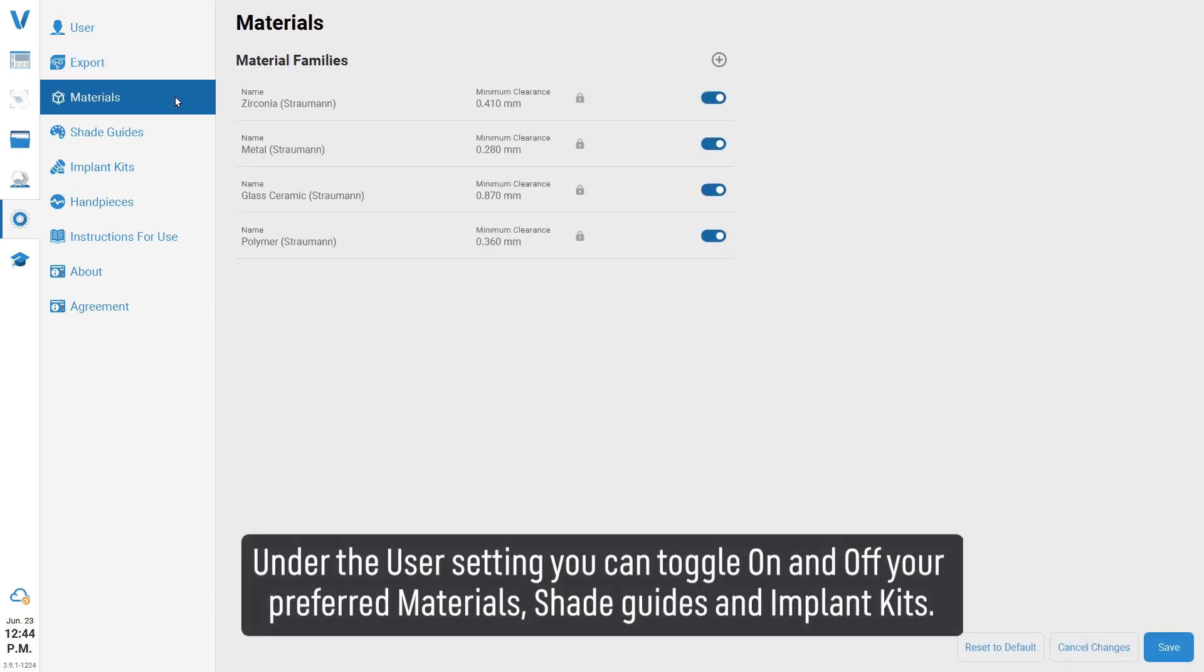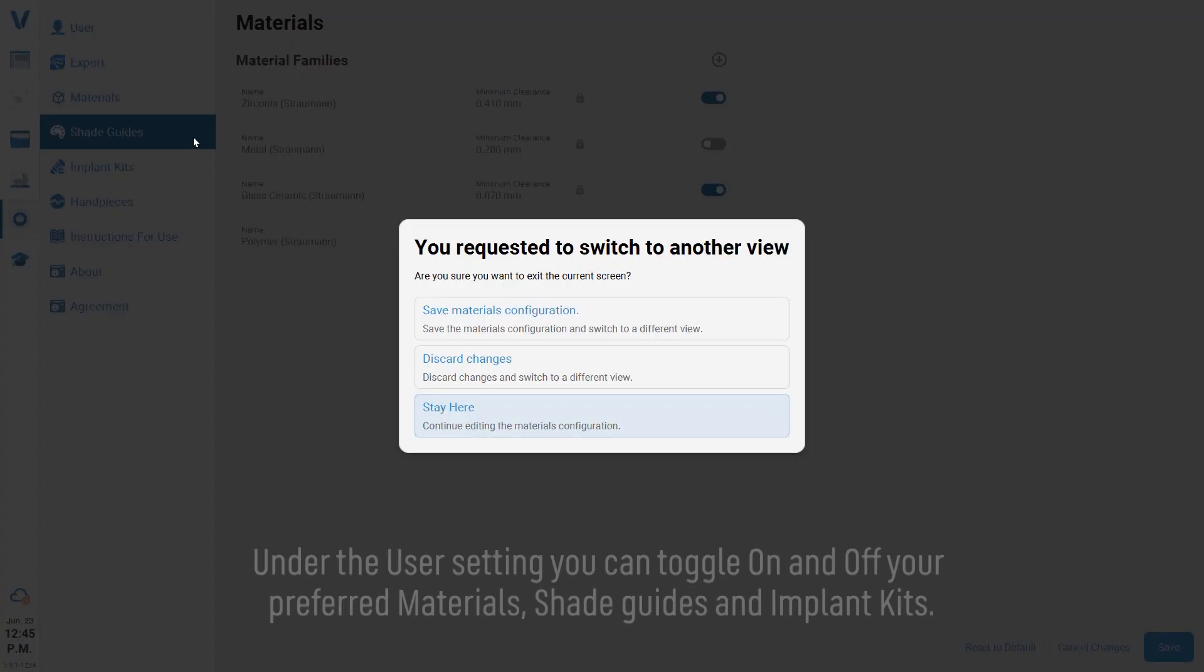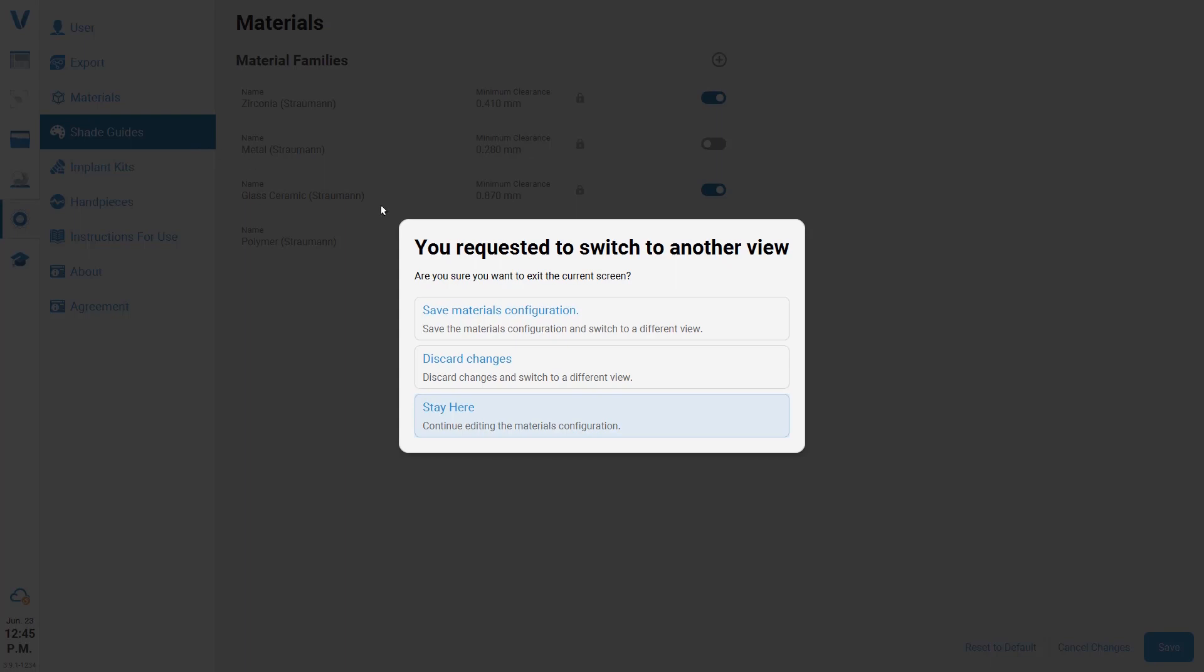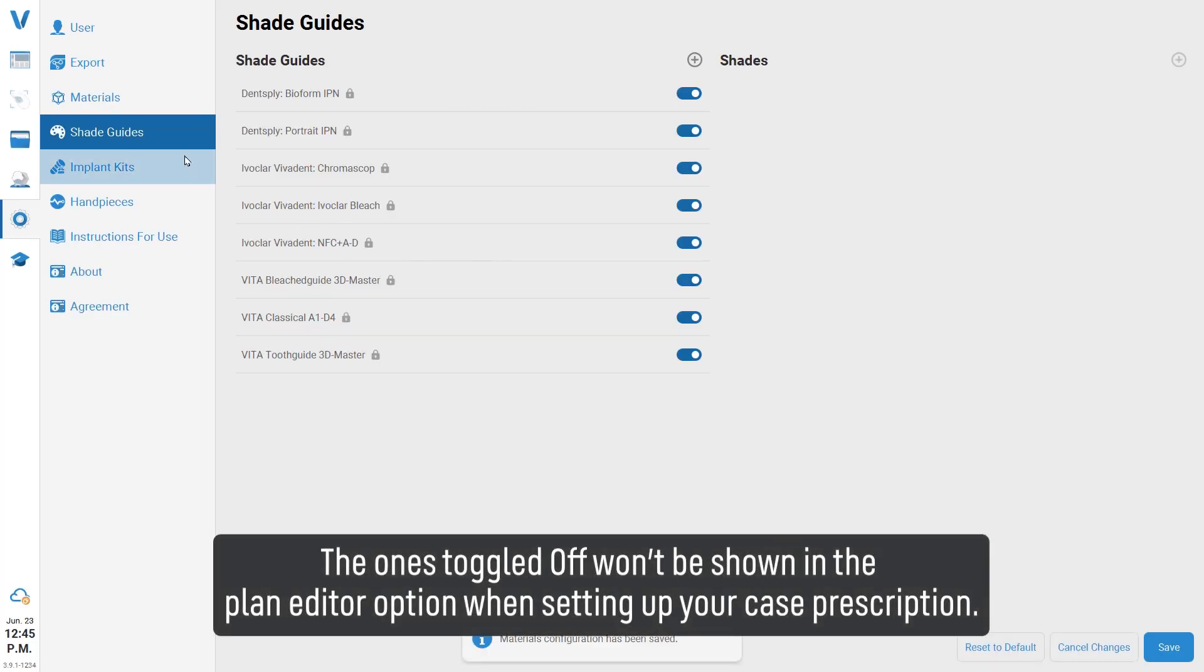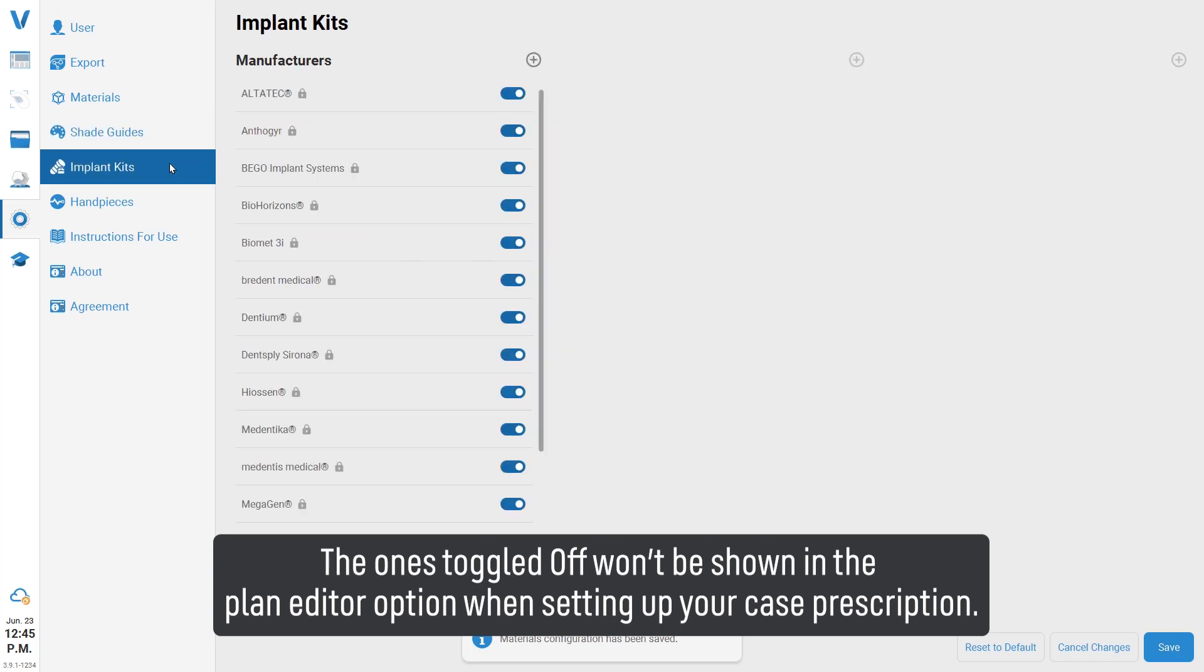Under the user settings you can toggle on and off your preferred materials, shade guides, and implant kits. The ones toggled off won't be shown in the plan editor option when setting up your case prescription.